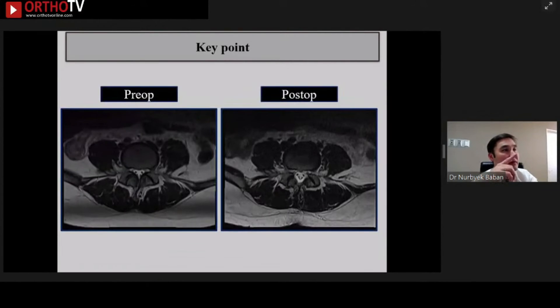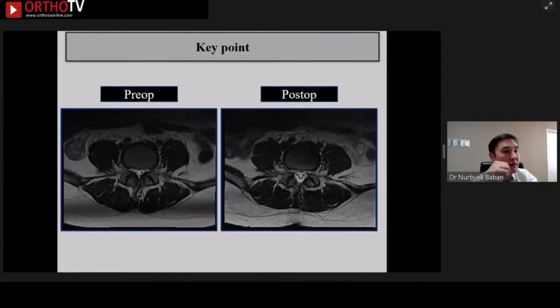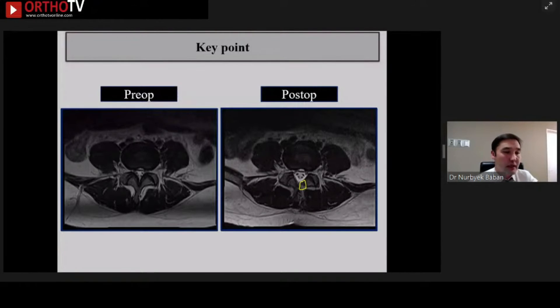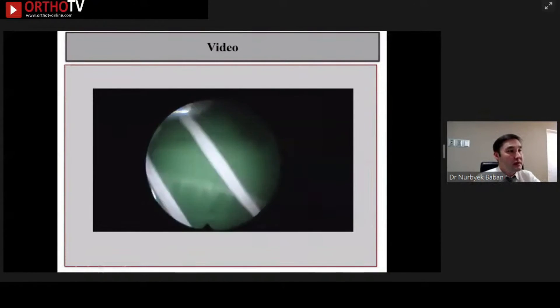This is an operation case example showing pre-op and post-op nerve root images. You can see the nerve root. The ligamentum flavum was totally removed in this case. This slide shows which nerve is compressed by the superior articular process (SAP), with post-operative full decompression of the SAP. This line is the entry point of the scope. We can remove a small amount of lamina and achieve full decompression. I think the uniportal scope can achieve this from a small entry point.